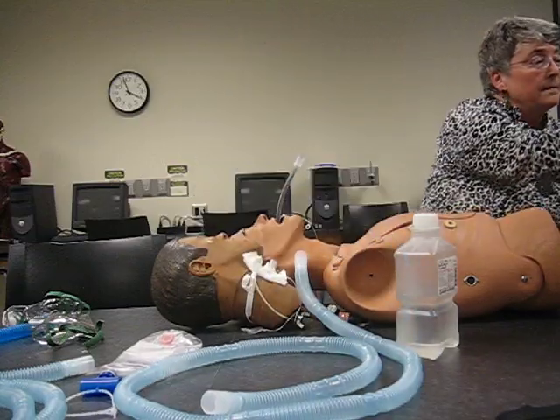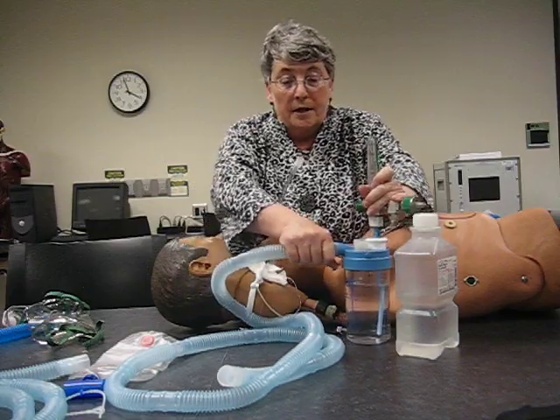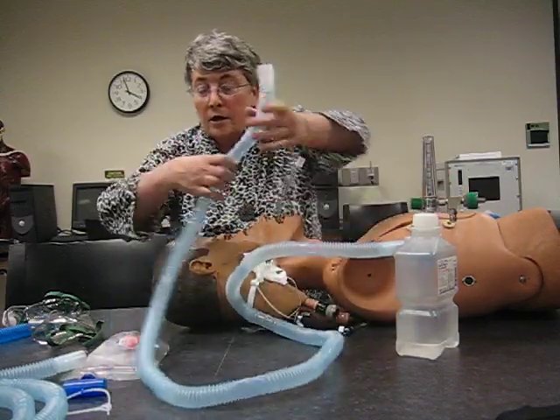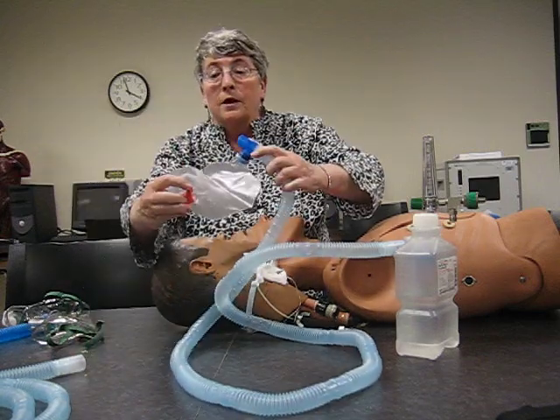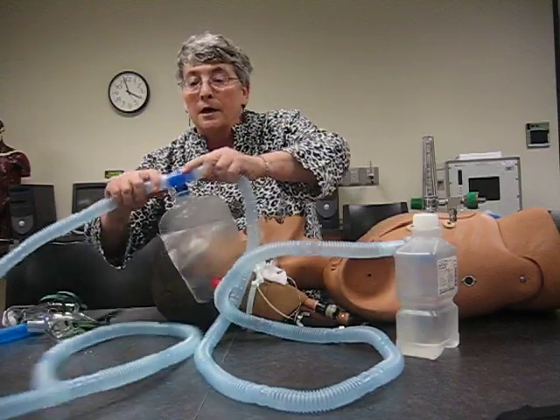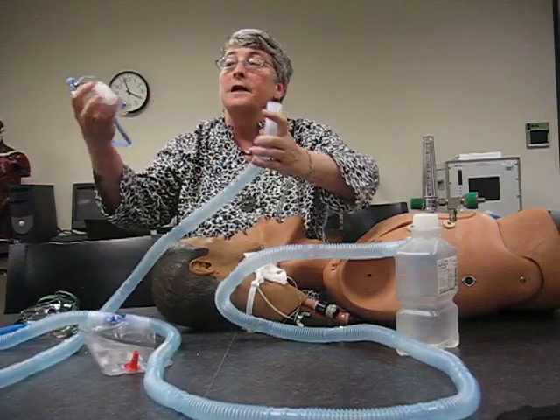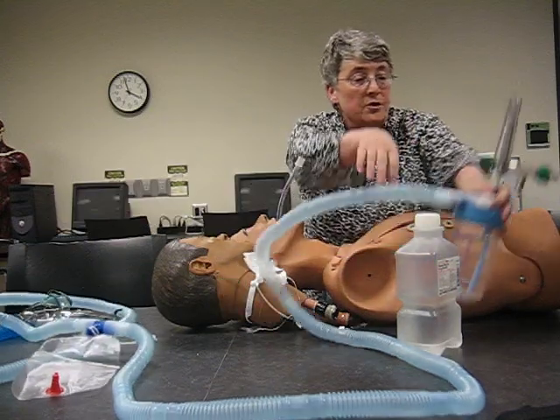After I set this up, I put a hose on. This hose is going to go to my water trap, and I close this off. When I have to drain the hose, I'm going to drain this into the trash. Then I attach my other hose, and finally my patient interface — which in this case is a trach collar. Now I'm ready to attach this to the oxygen.